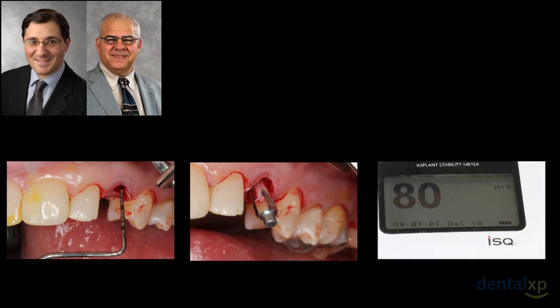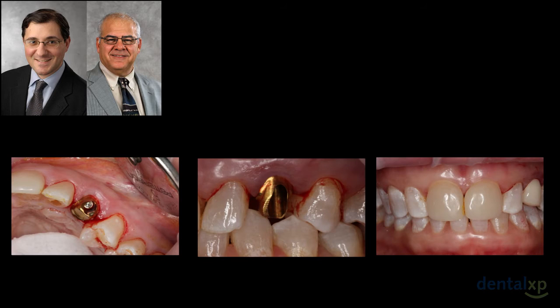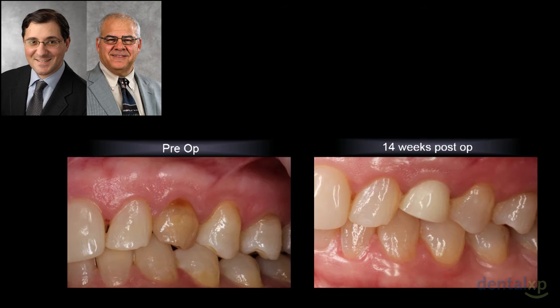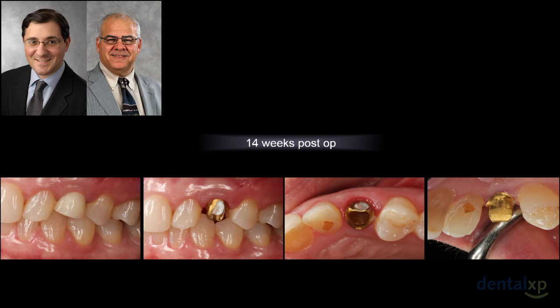We extract the tooth, the guide goes into place, the implant is positioned with a very high ISQ reading. The Atlantis abutment drops right into place. A non-occlusal function provisional is placed to maintain the soft tissue position. You can see the radiograph with the implant. Here's a 14-week follow-up — from a soft tissue standpoint it looks fantastic. When we take the provisional off, we can appreciate the sulcular health from both the buccal and the palatal aspect.